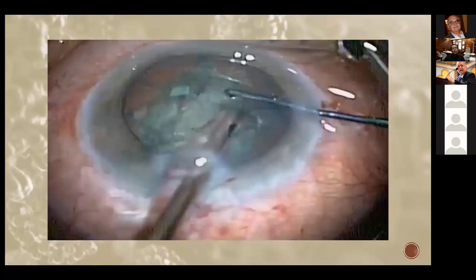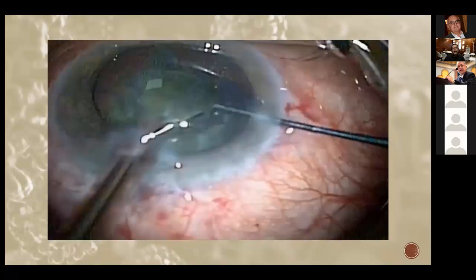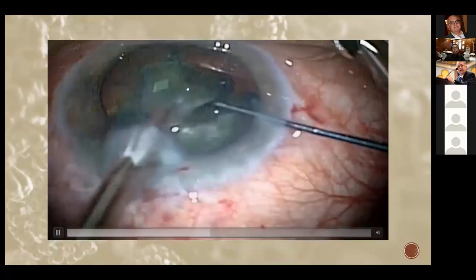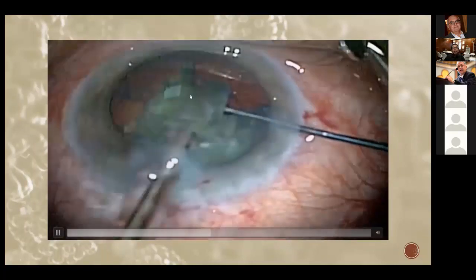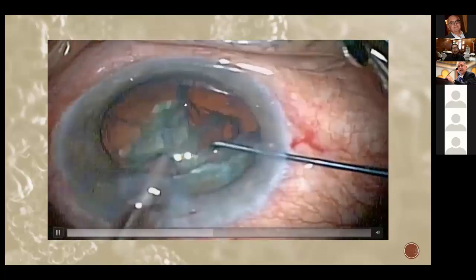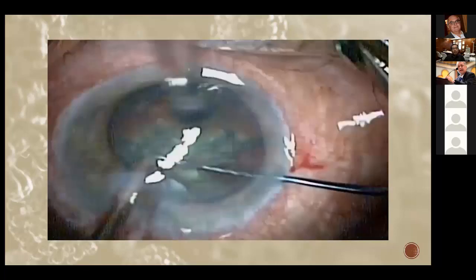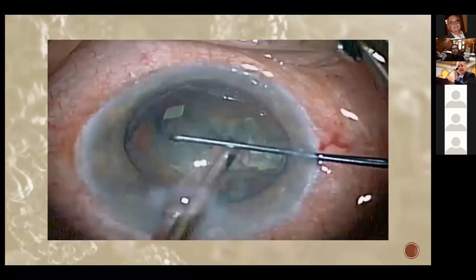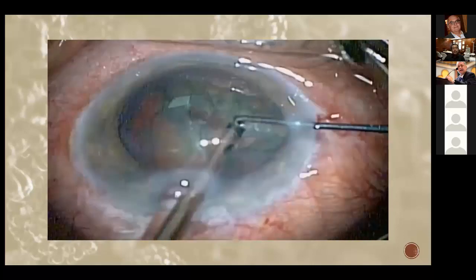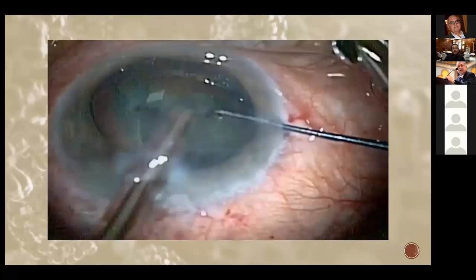Now I'm not going to do any more rotation and I'm going to take this quadrant and take it out. Because I did hydrodelineation, I don't have any load, so the nucleus comes out easily for me. It's very easy now, and with high vacuum, I can finish it. Now I'm trying to get the rest of the nucleus. I complete my division totally. Now the nucleus is moving inside the bag. It's not dragging the bag with it. It's moving inside the bag. And now I'm doing the chopping.